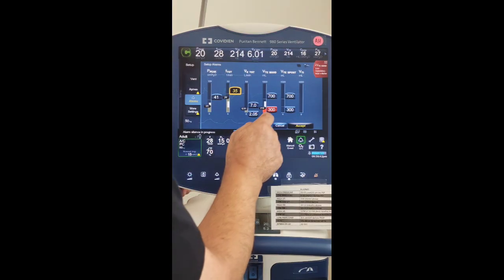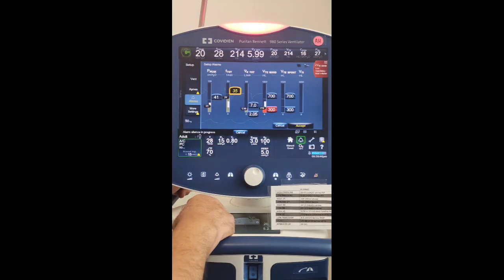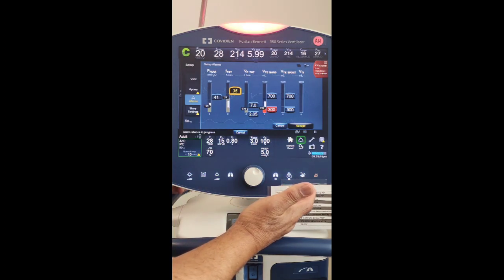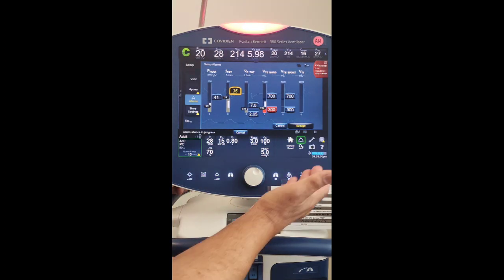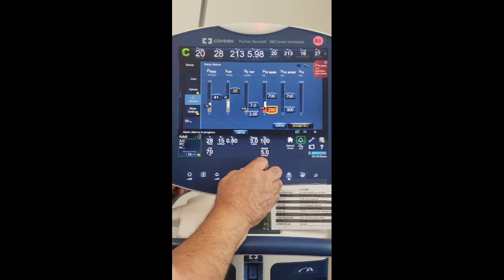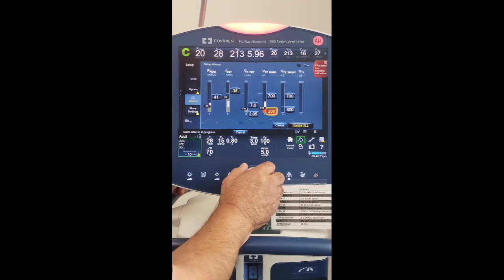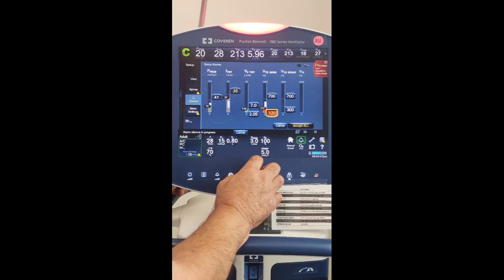Okay, and so tidal volume now, the baseline's 214. Well, you can't go down to 0. So we're going to have to at least go down, let's go down to 100. So this is where some variables are not exactly, we're going to go down to 113. Okay, 110.